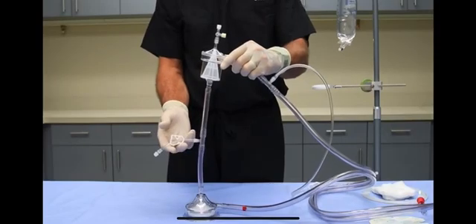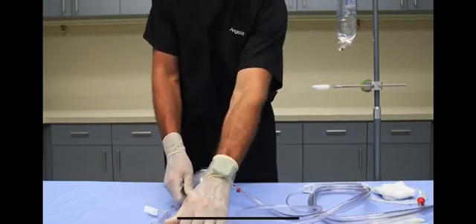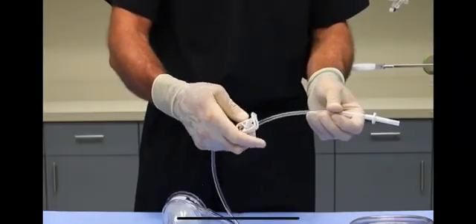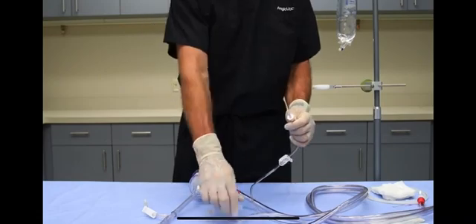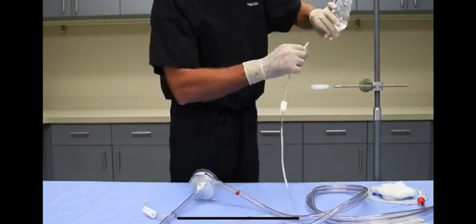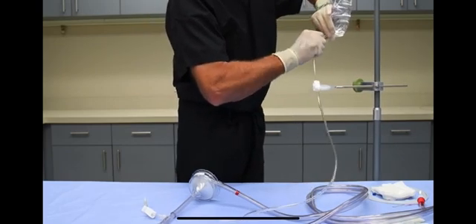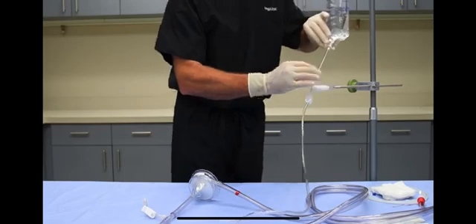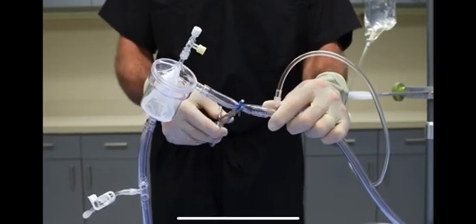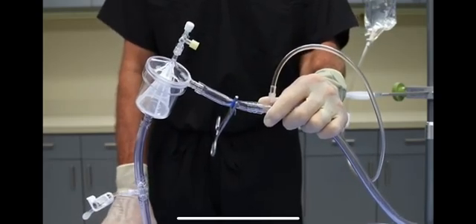In preparation for priming the circuit, the perfusionist must close the tubing clamp on the waste line. Before spiking the fluid bag, close the priming line tubing clamp and spike the fluid bag. Finally, place a perfusion clamp securely on the blue marker at the bubble trap inlet. The Angio-Vac circuit is now ready for priming.